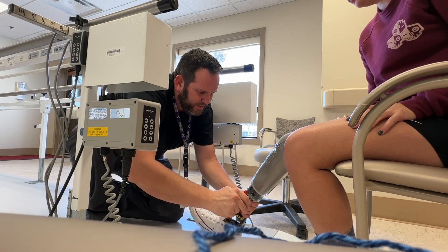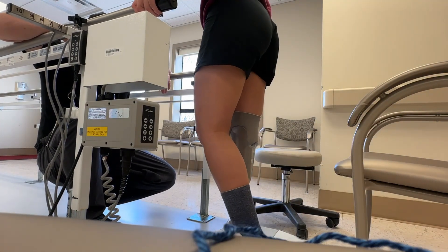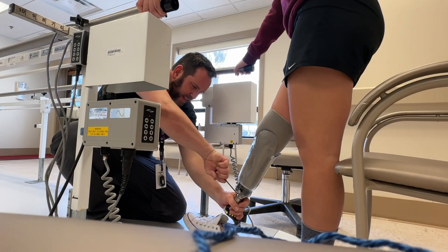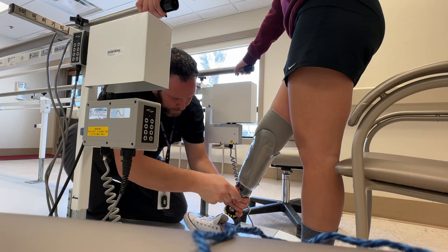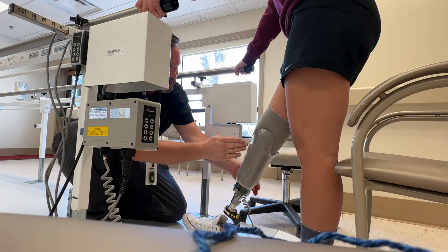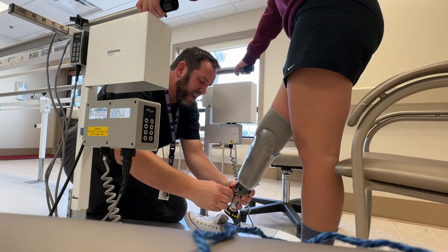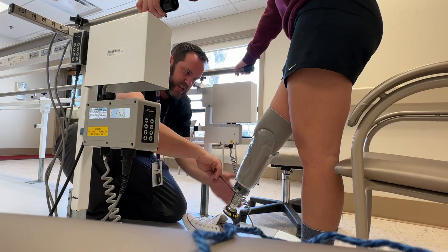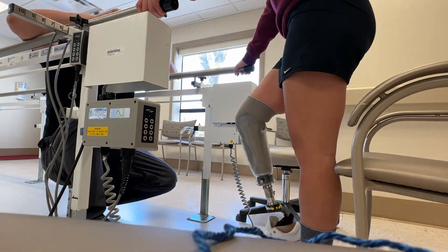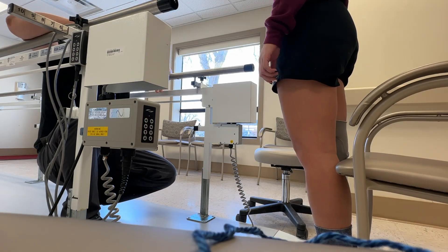We've got to wrap this still. I'll push it to the limit. I know, and that's why we have to have the Loctite. Still looks like we've got to go more. That's something you'll learn about me — my body is weird. The thing is, everybody's tibia has a curve, and depending on where they amputate, we'll decide how much we have to bring this out. Some people it's just a straight shot. Part of what makes that cosmetically look nice is they took all those alignment adjustments and built it into the bottom of your laminated socket so it masks it and hides it all.